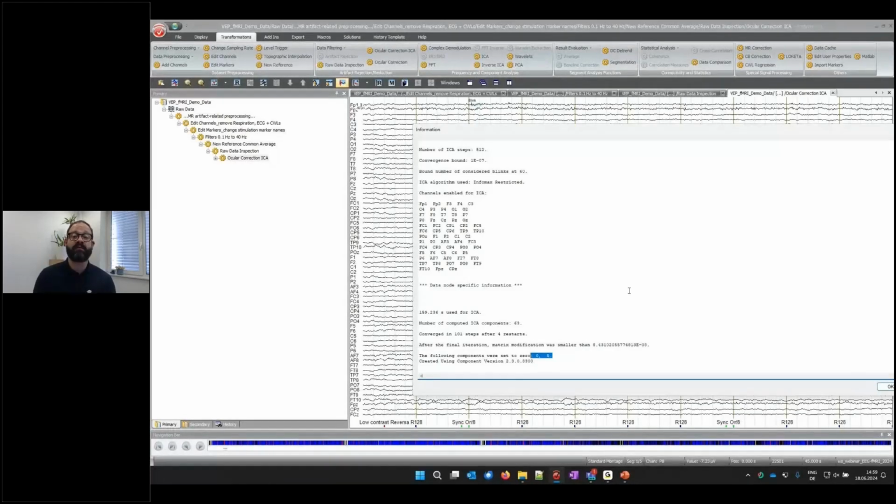So something like persistent muscle tension is usually picked up nicely as an ICA component, but also, and this might be a nice feature if you have EEG-fMRI data, if you have residual pulse artifact in the data, this could also come up nicely as a component because this is usually persistent over time. However, this was not really the case in our data here, also because we used the carbon wire loop regression as a pre-processing method, which is rather good to get rid of the pulse artifacts.